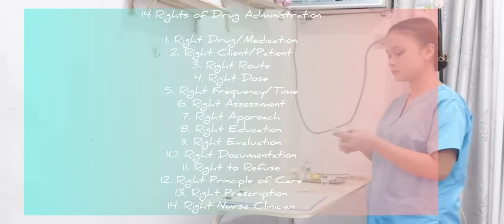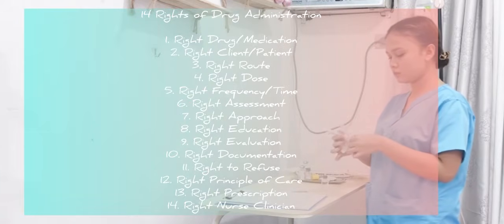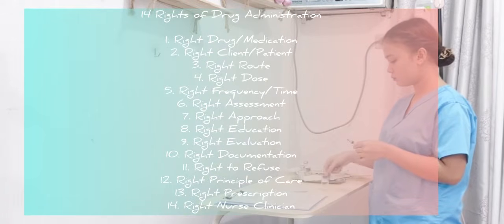Then wash hands to reduce transmission of microorganisms. Then observe the 14 rights when preparing and administering medication. It allows nurses to give drugs safely and to monitor clients' response to therapy.